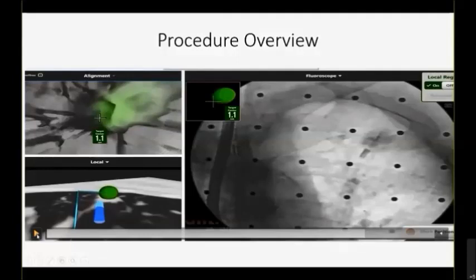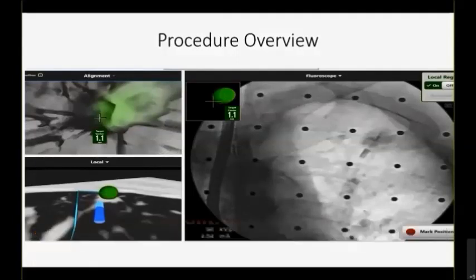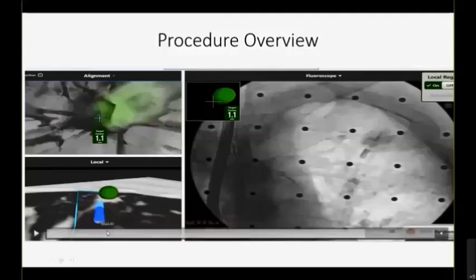So just to point out a couple of things, the different screens you can have, I found very, very interesting. They're really cool. So you can do a lot of different things here. We actually can have the fluoroscopic image now on the EMB screen, as well as what other kind of fancy endoscopy suites that you might have. You can go ahead and start it again now.